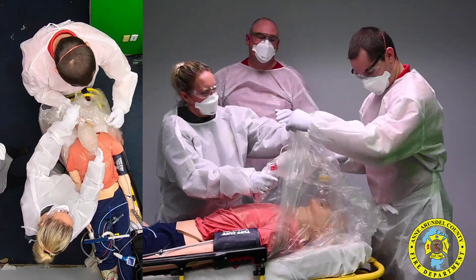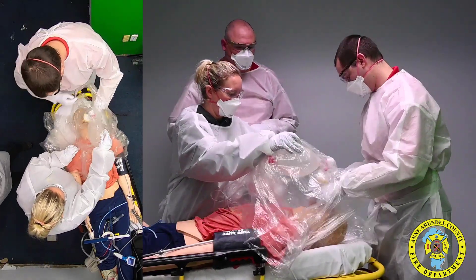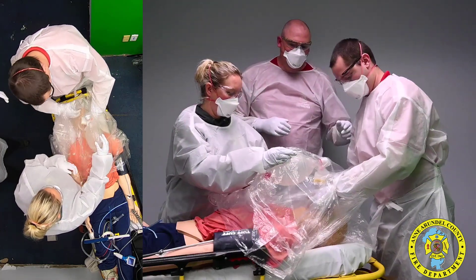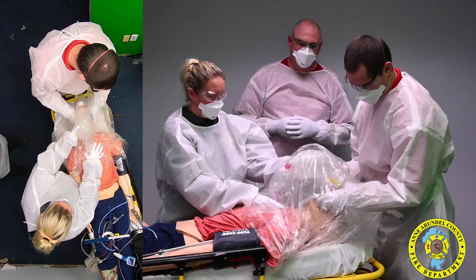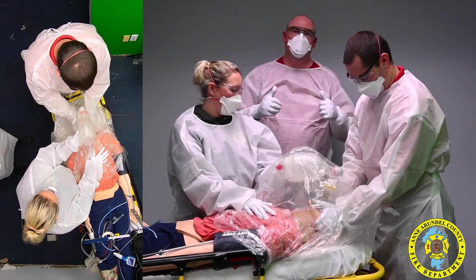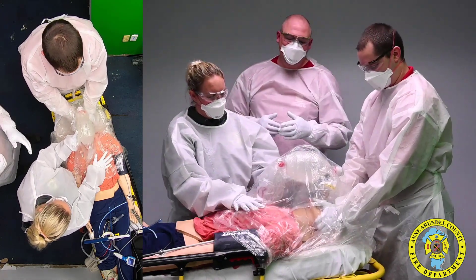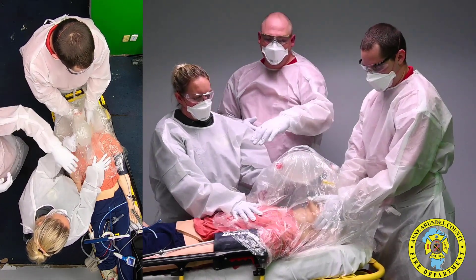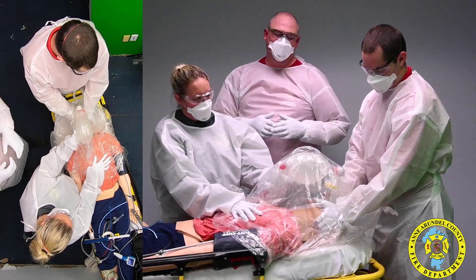You can see our clinicians applying the bag valve mask for BVM ventilations. The clinician is gaining access to the inside of the poncho using the arm holes so that he can get a good two-thumbs-down technique on the bag valve mask. Our second clinician has the patient securely covered and is bagging or ventilating the patient from outside the car.